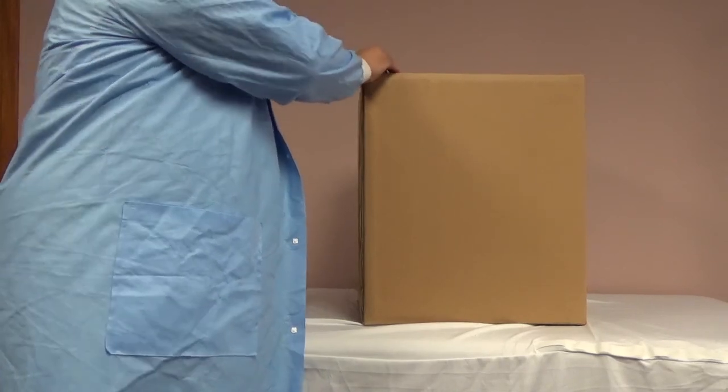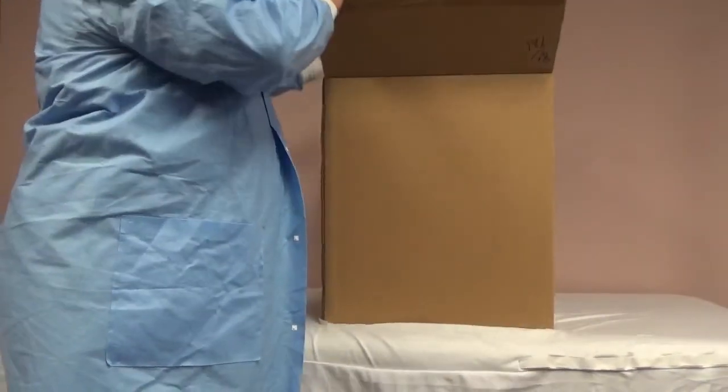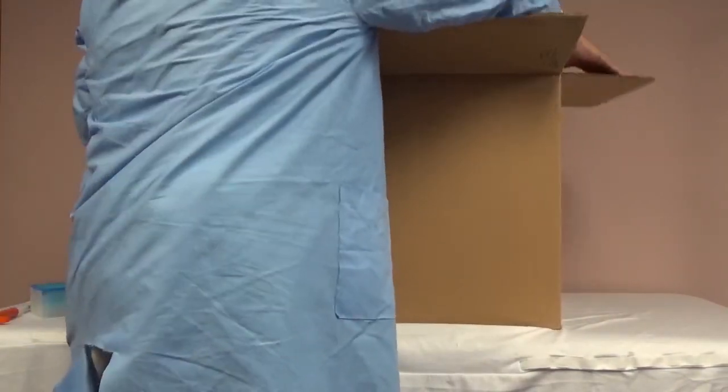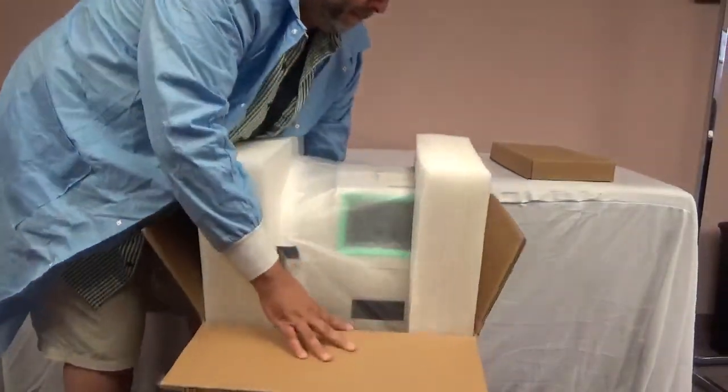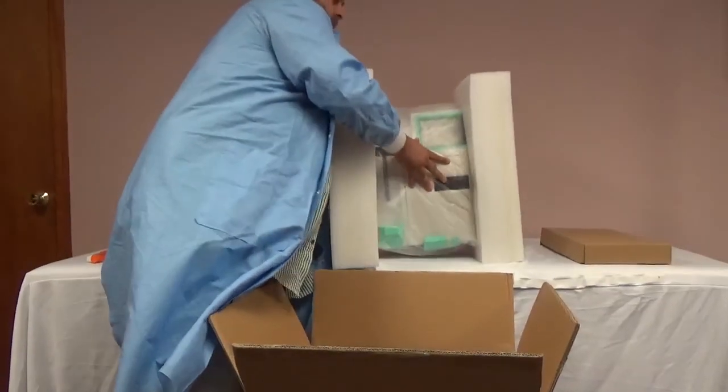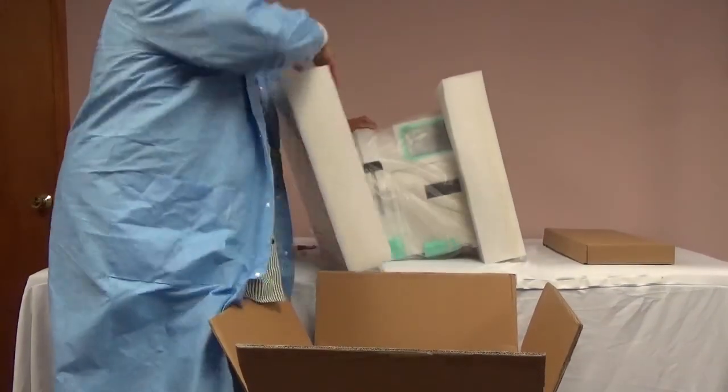When you receive your E-Lite Plus electrolyte analyzer, you will begin by removing the instrument from the packaging. Cut and remove the tape from the top of the box. Remove the accessories kit followed by the instrument. Place the instrument on the table, remove the styrofoam and unwrap the plastic cover.